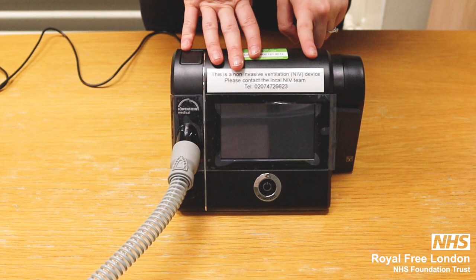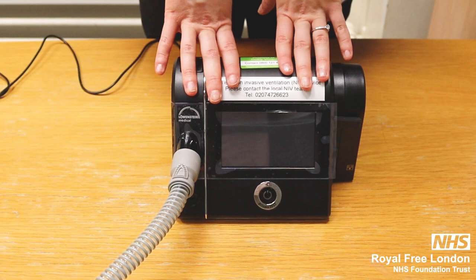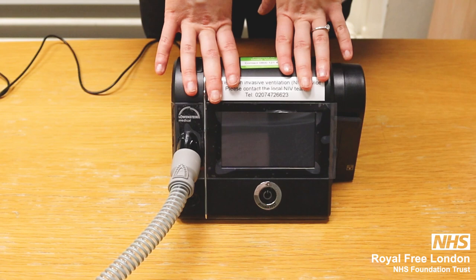This machine has a mode called night semi mode, so during therapy the screen will go dark black. Don't worry — that's okay. Just make sure the machine is working and that the power cable is plugged into the mains and at the back of the device.